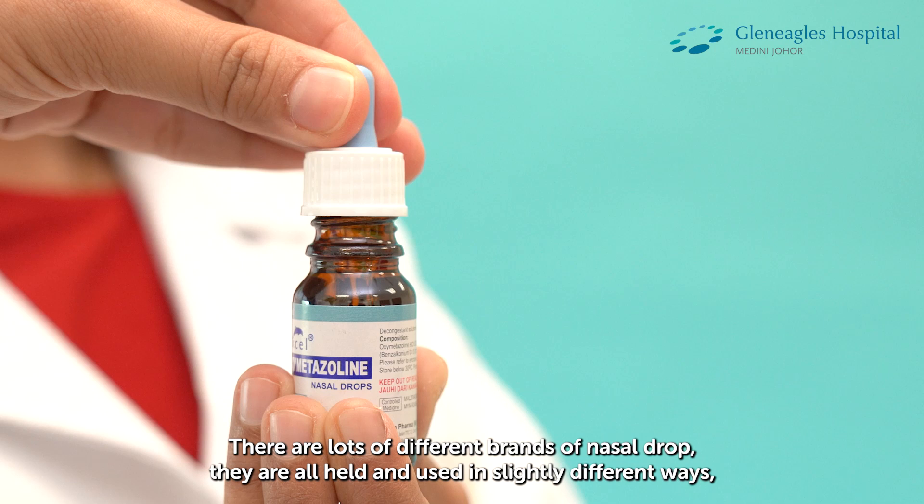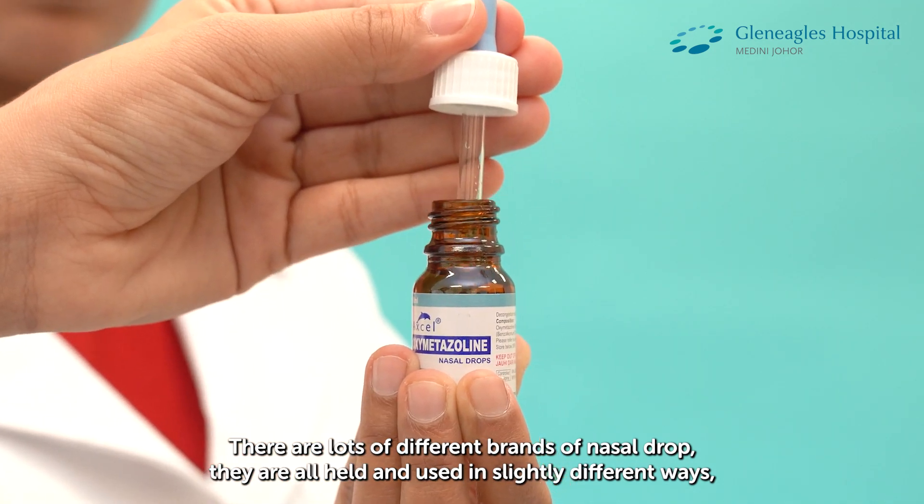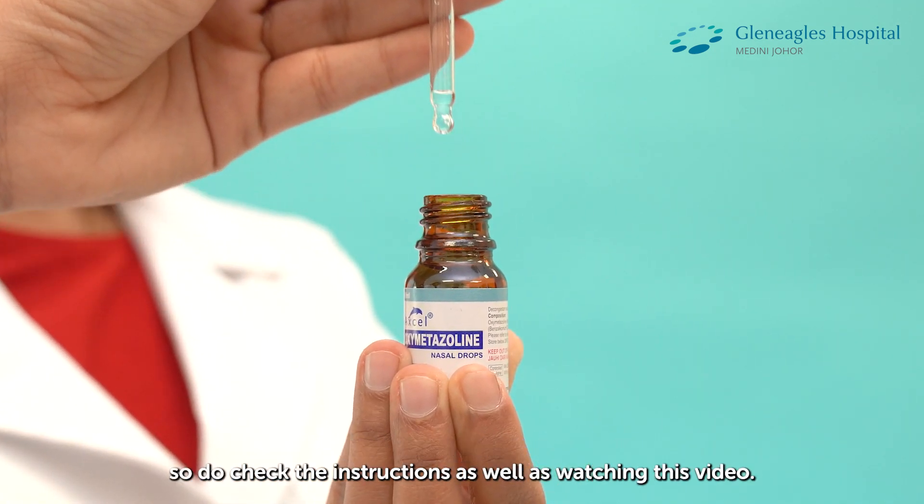There are lots of different brands of Nasal Drop. They are all held and used in slightly different ways, so do check the instructions as well as watching this video.